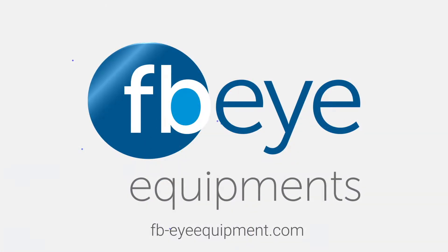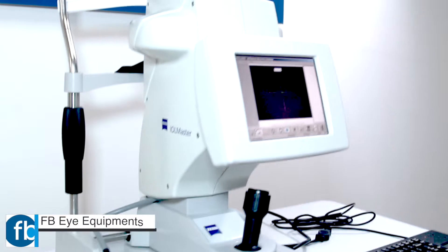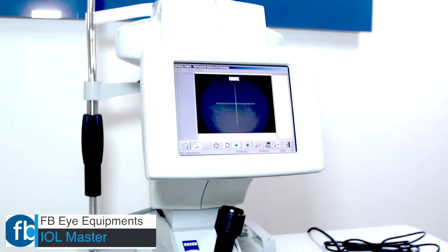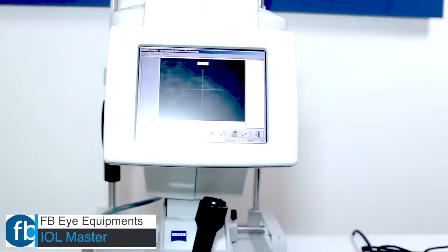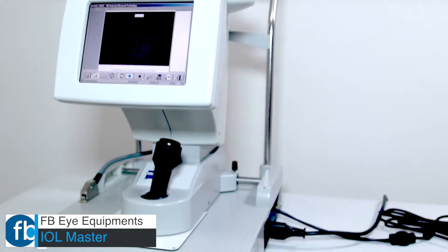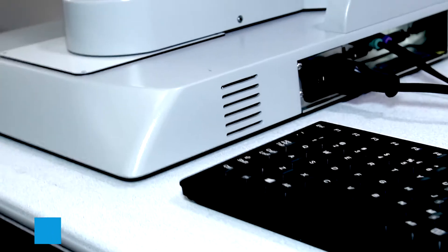FB Eye Equipments presents the IOL Master. The IOL Master is the most sophisticated and precise optical instrument used in the preparation of cataract surgery.